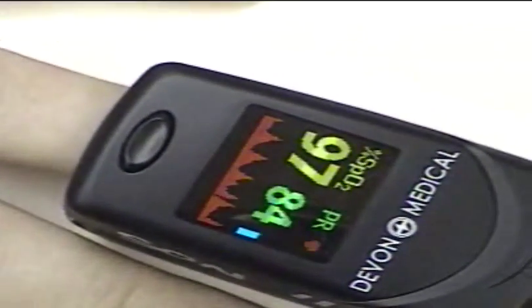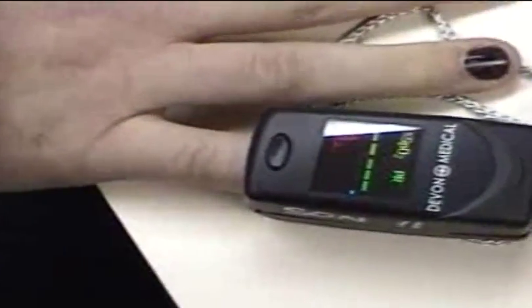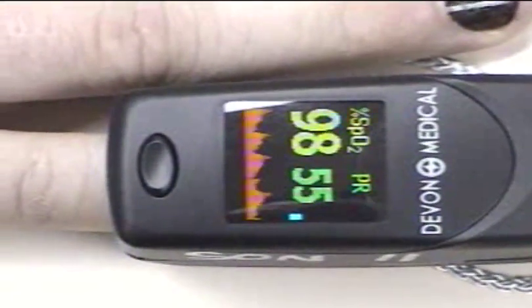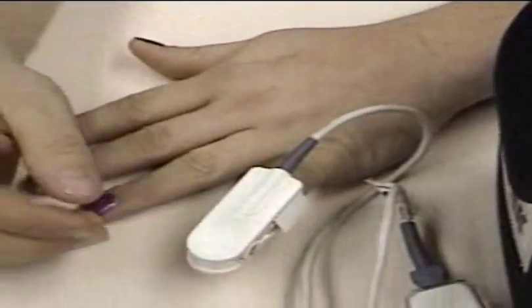Let's go ahead and put it on a color. This one's the biggest — 97%. Does anybody have a metallic polish? That was a pink with a 99%, then 98%. Now this will be the control — the one nail that doesn't have anything. We're going off the light pack 12. We have a reading of 99% with a heart rate of 102.